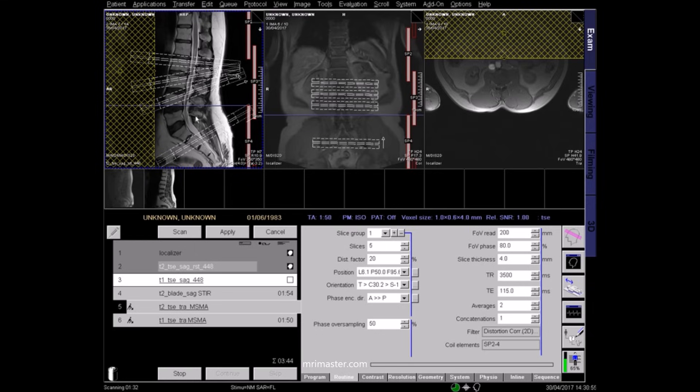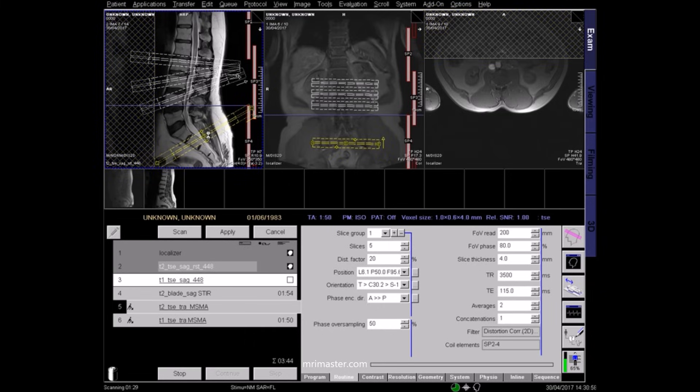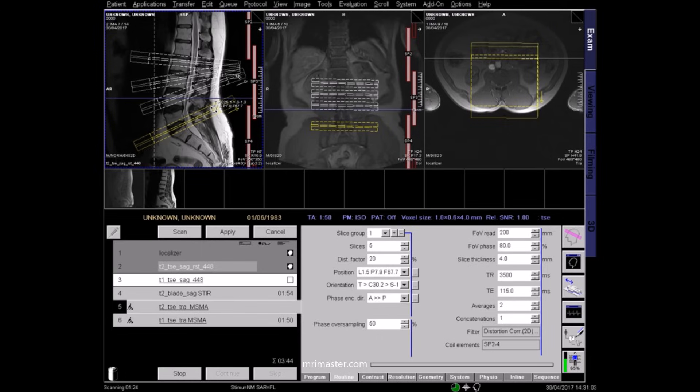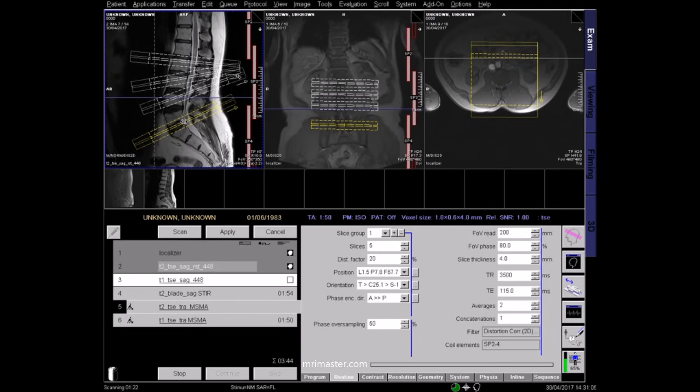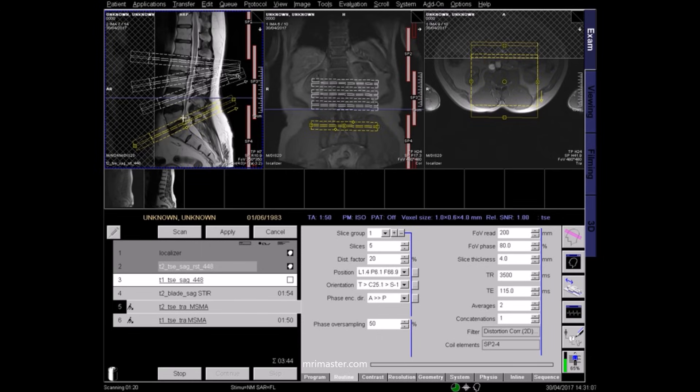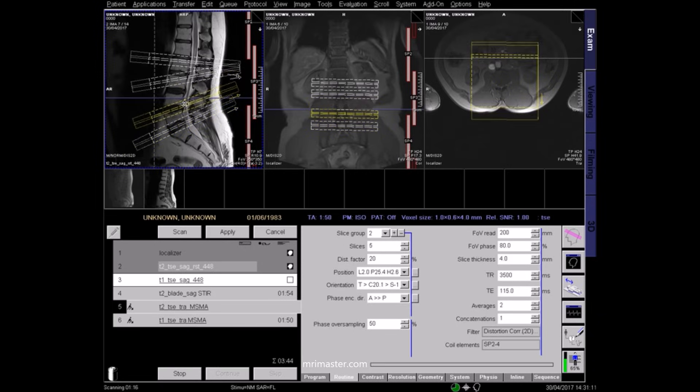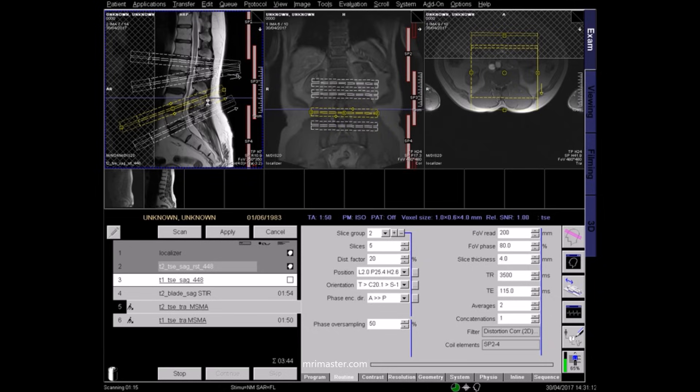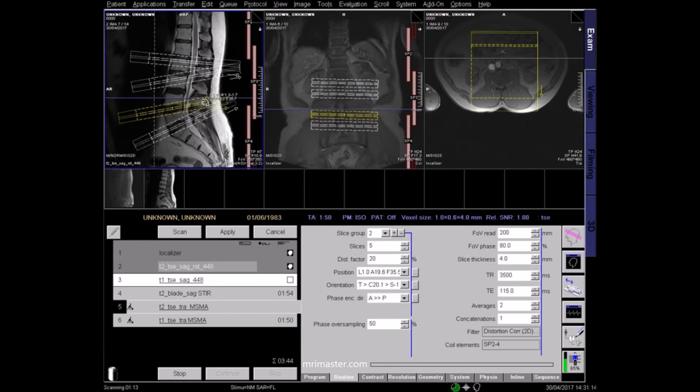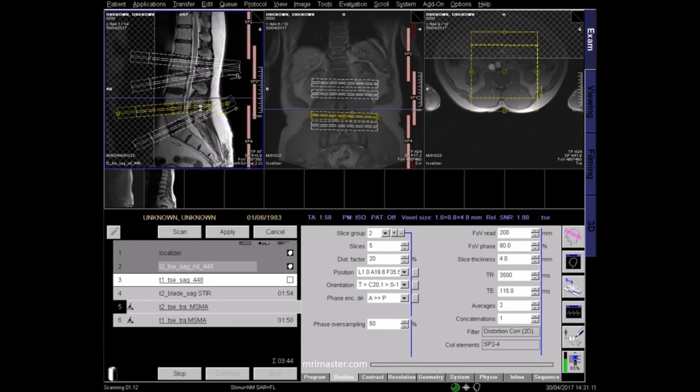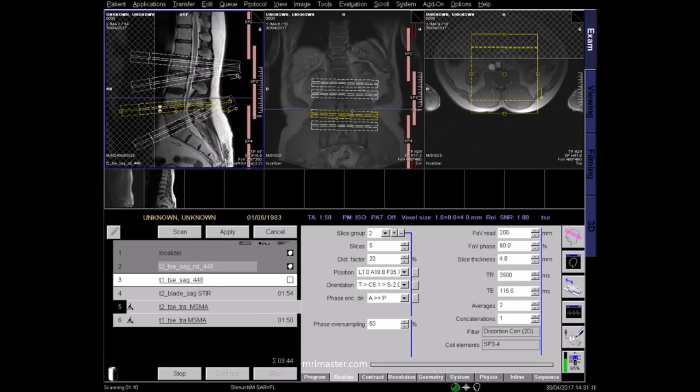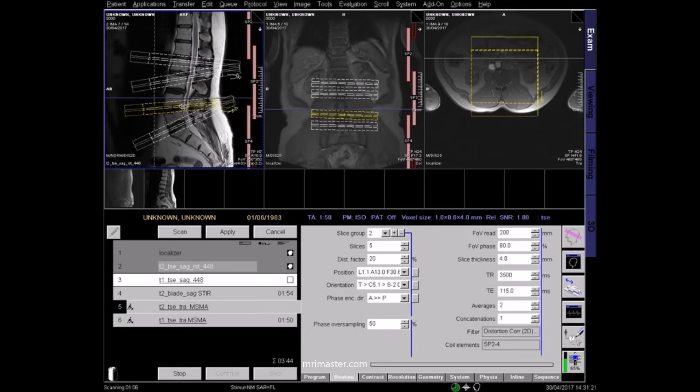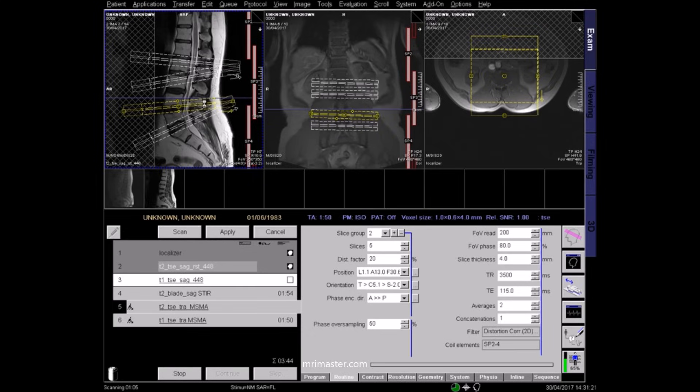Angle the slice blocks parallel to each intervertebral disc to acquire true axials. It's important to avoid excessive overlap by adjusting the block angulation. Overlap between the blocks can result in crosstalk artifact, which may overlie areas of interest on the resulting images.